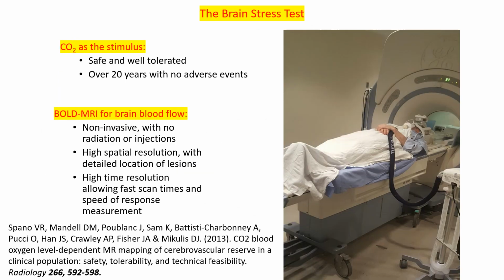We have conducted CVR testing for over 20 years, both experimentally and clinically, and found them safe and well tolerated, with no adverse events encountered. The picture on the right shows our gas delivery system connected to a subject in the MR environment.